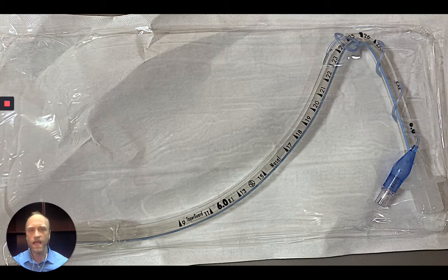I heard of a recent case in which a tall patient was intubated using the nasotracheal route, and the ET tube was under some tension because the tube was just a bit too short for this tall patient. Due to that tension, the ET tube adapter popped off and the ET tube itself receded into the nasopharynx. Talk about an airway nightmare. So I like to have some of these extra long tubes designed for nasotracheal intubations available in the ED for such cases.